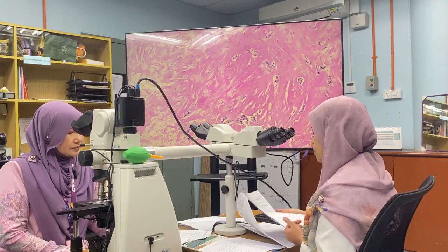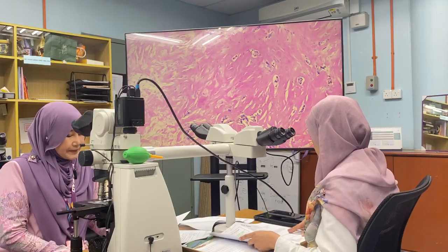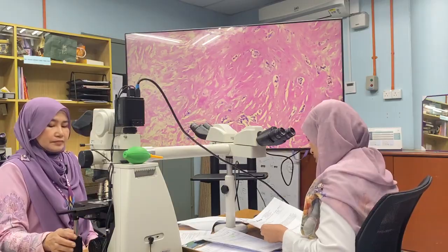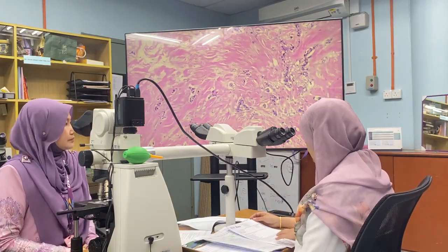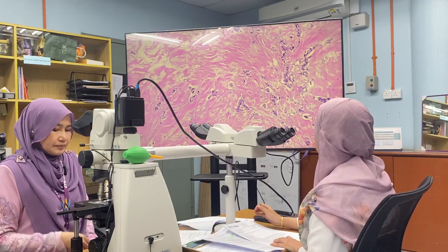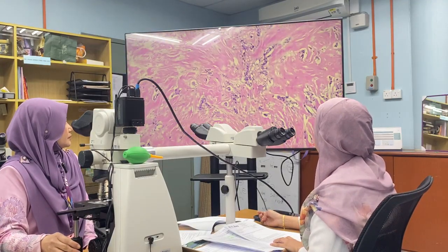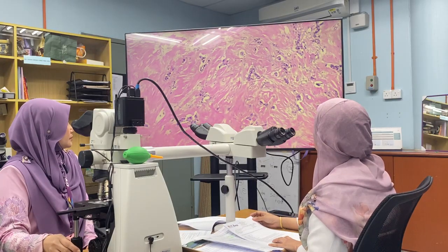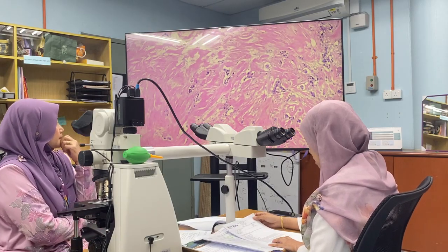On microscopy, this is a breast specimen showing viable malignant cells, Prof. The cells are within the fibrotic stroma. The malignant cells are arranged in cords and single nests with minimal tubule formation, for which I score 3. The cells exhibit moderately pleomorphic nuclei with prominent nucleoli and moderate amount of cytoplasm.